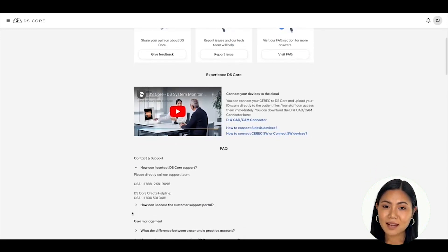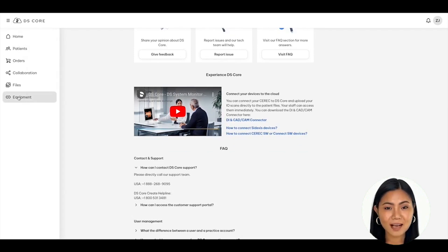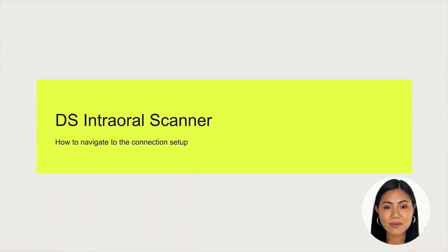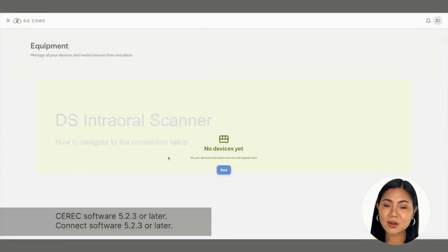I'm going to navigate back to the equipment list by opening the main menu and clicking on Equipment. Let's get started with how to connect an intraoral scanner. Open a web browser on your Dentsply Sirona intraoral scanner, such as a PrimeScan, running CEREC Software 5.2.3 and/or Connect Software 5.2.3, and log into DSCore.